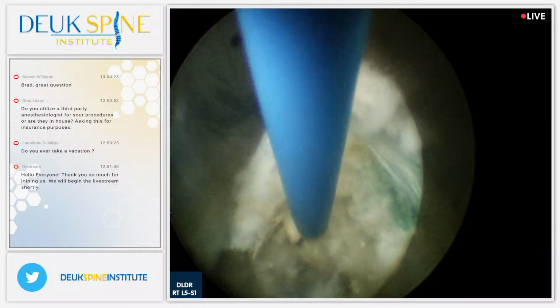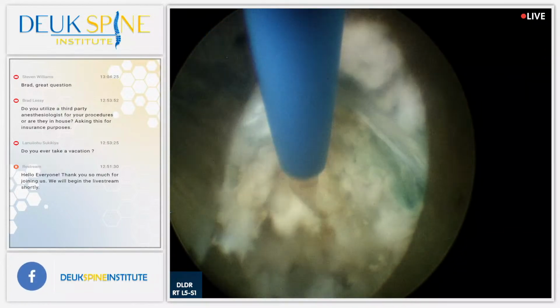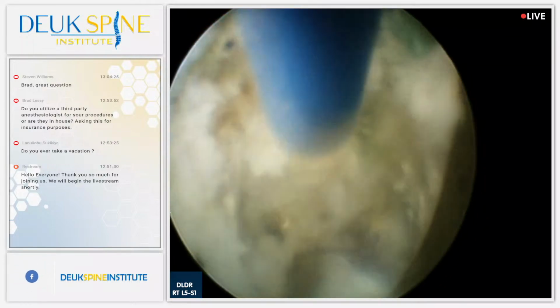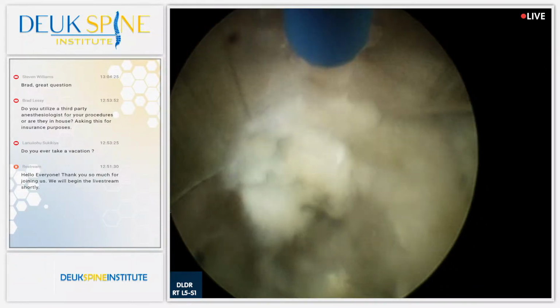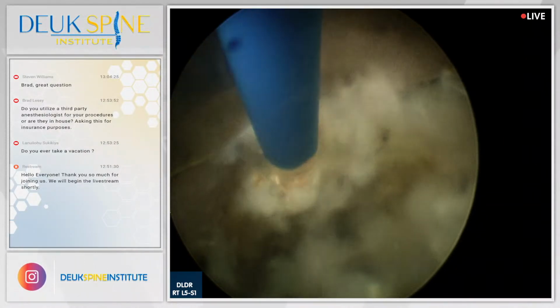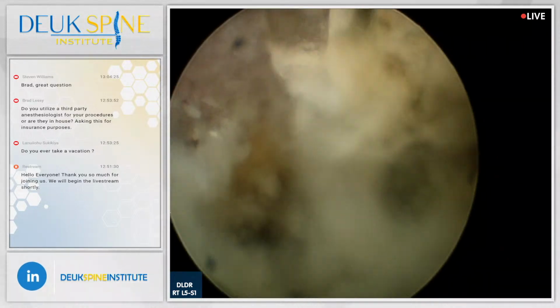You can see all the scar tissue right here. This is where the herniation is. We are literally in the herniation right now. I just took a big piece out a minute ago while you guys were watching, but there's still more herniation here, and I've got to get it out. So let's take some questions, and then we'll show the video on how we fix facet pain.